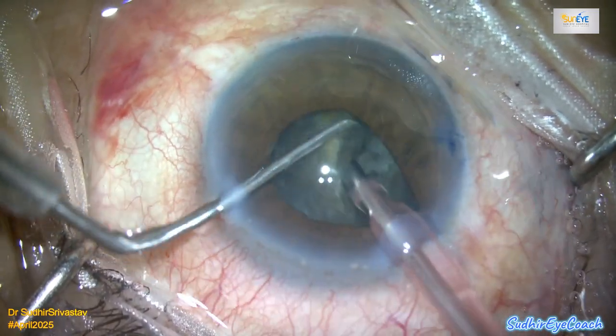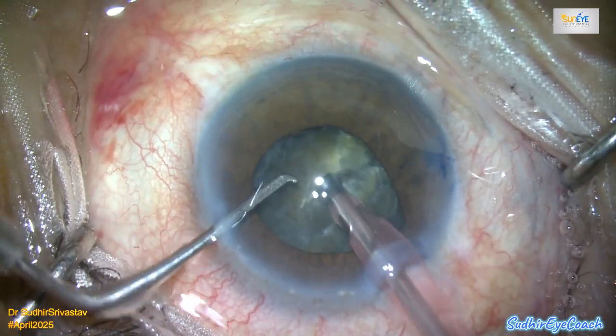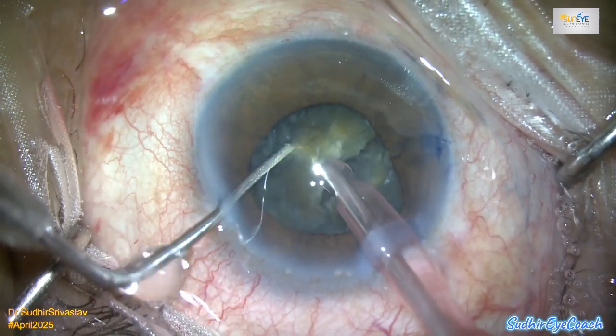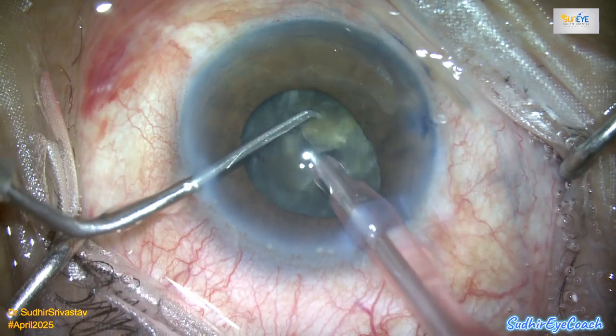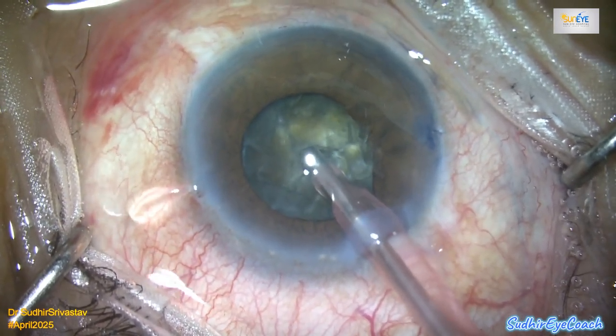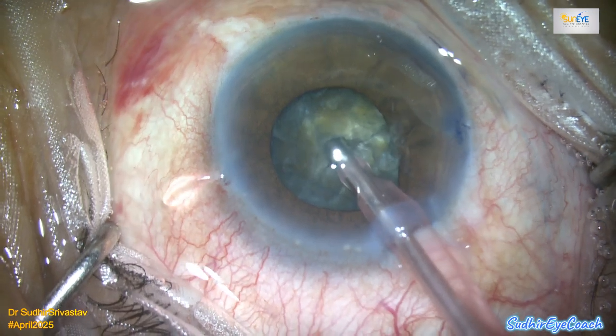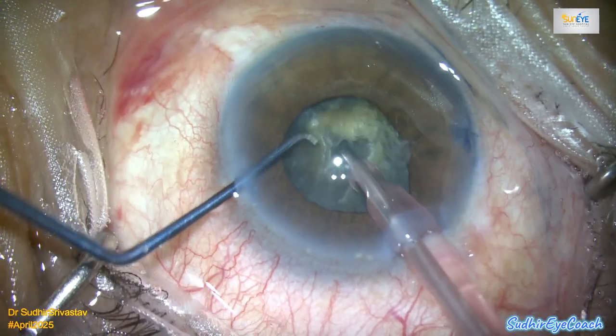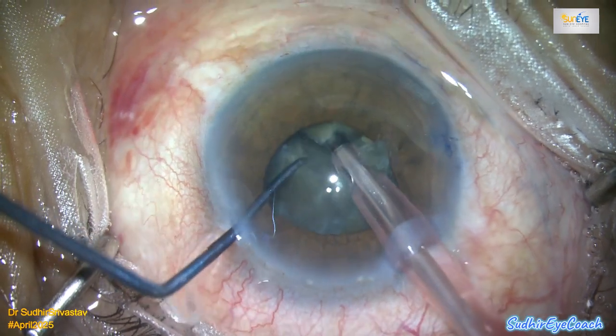First, keep your phaco tip centered at all times. Use the second instrument actively to bring nuclear pieces towards the center and to shield the iris from the phaco tip. Use low phaco settings to minimize fluid turbulence. Be gentle with the foot pedal. A sudden surge in fluid can easily catch the iris.